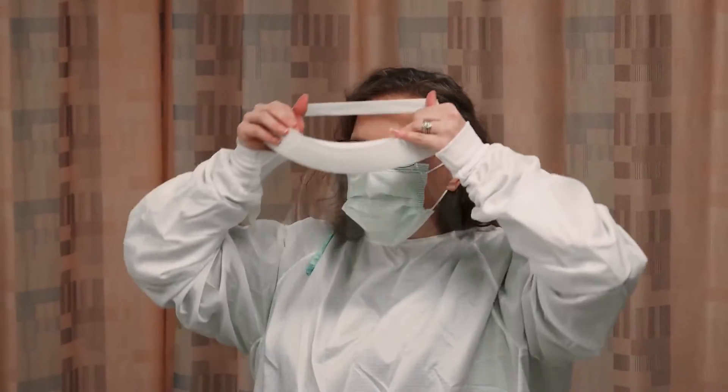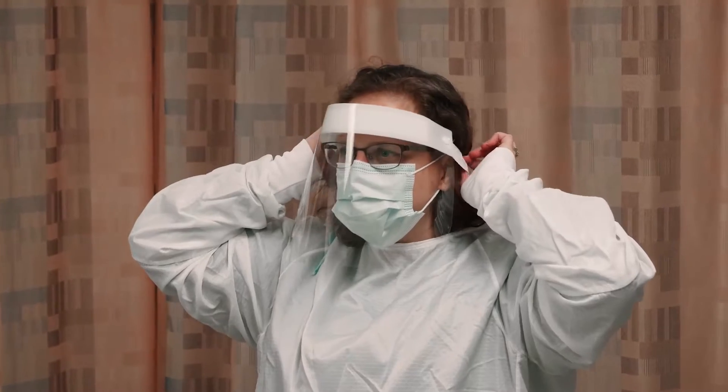And the next thing is the fun part — the goggles, or in this case a face shield. We can also have some fancy surgical goggles.